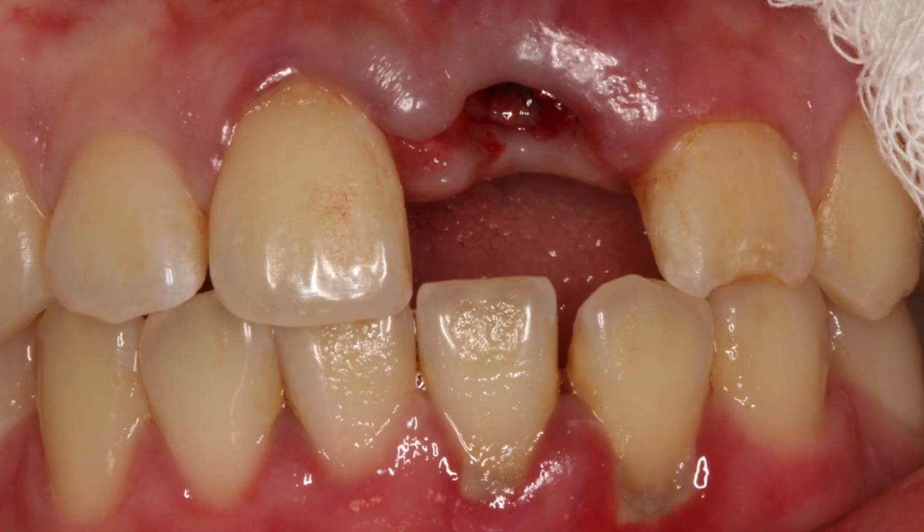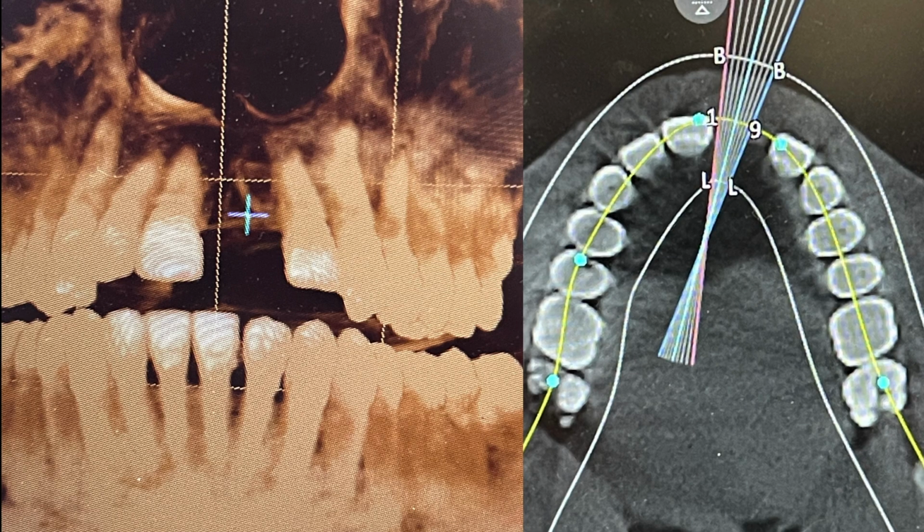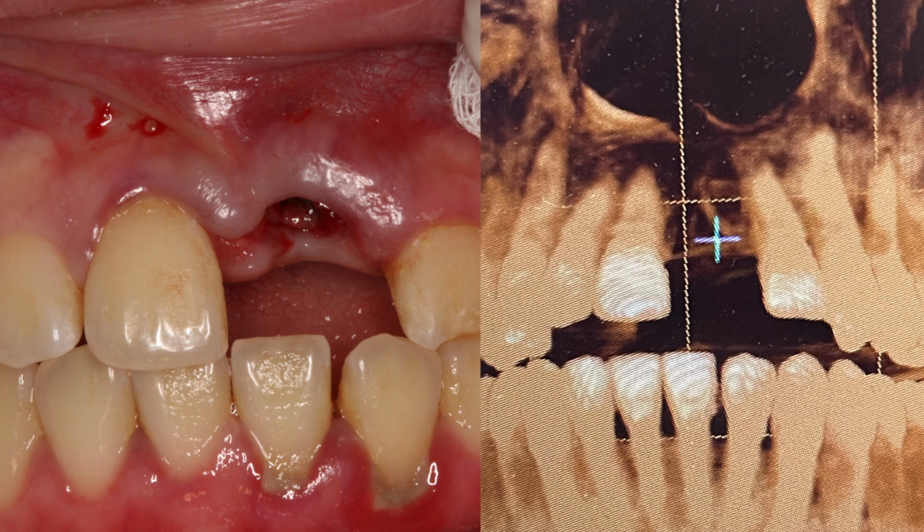But unfortunately, the patient had periodontal disease and poor home care with mild spacing, as you can see in the incisors. Therefore, malocclusion was evident. We were fortunate to have CBCT. Not all cases had this luxury at this program, but this is a CBCT that is representative of this patient. Notice the big difference here.